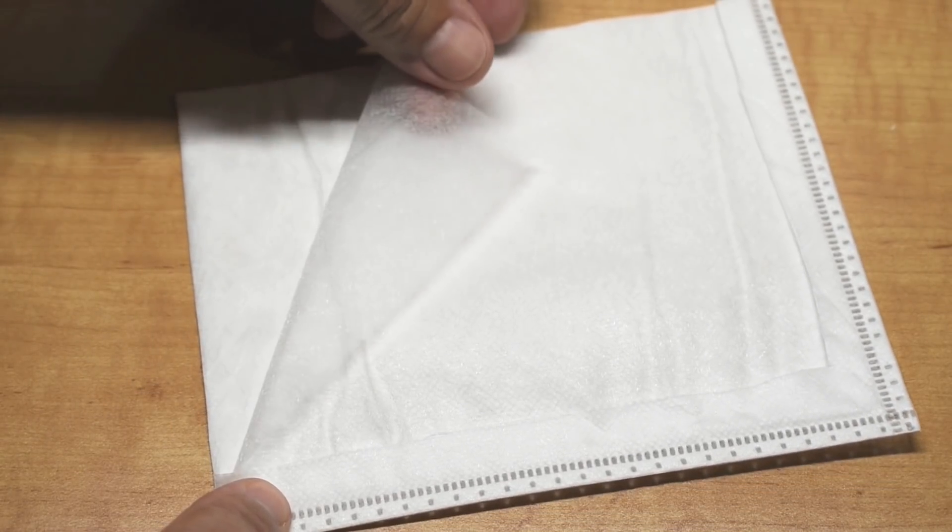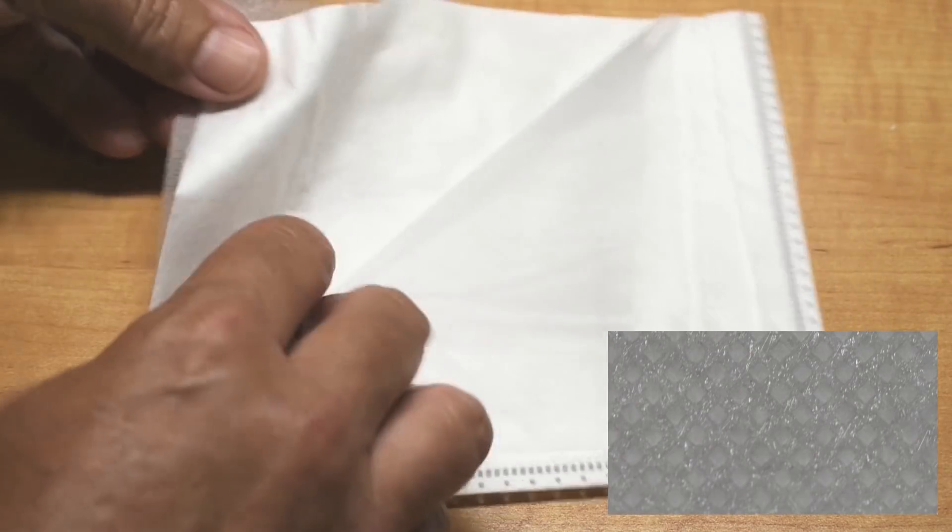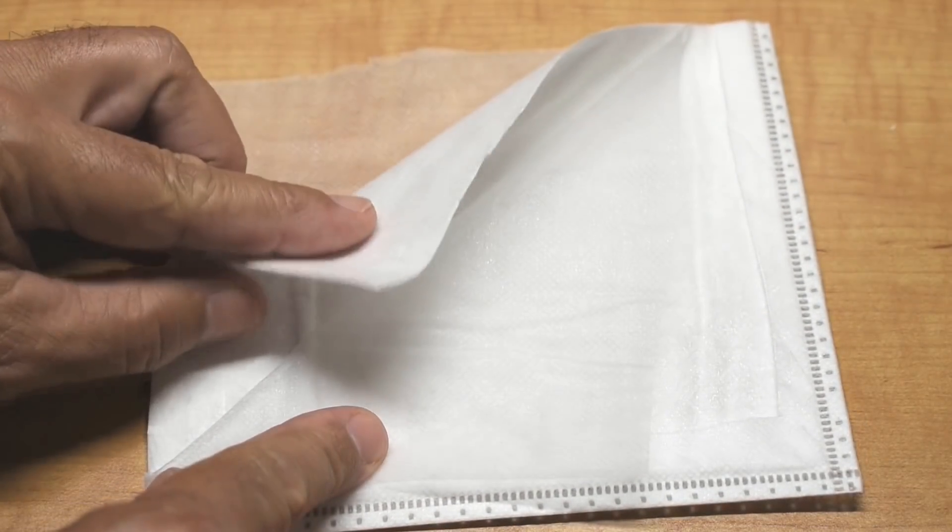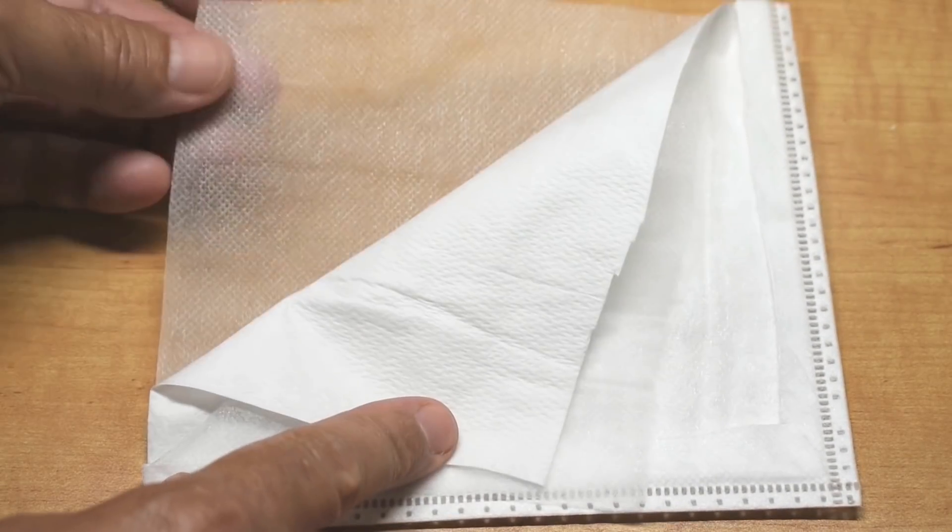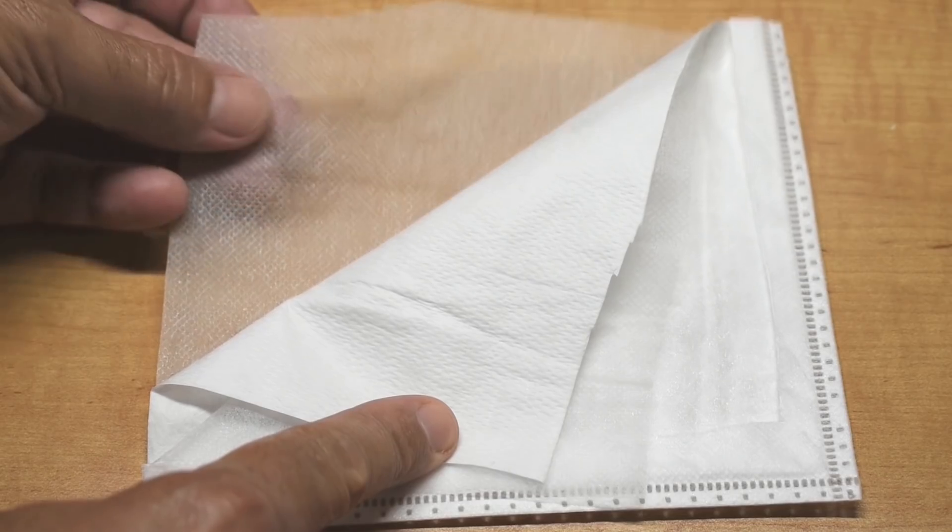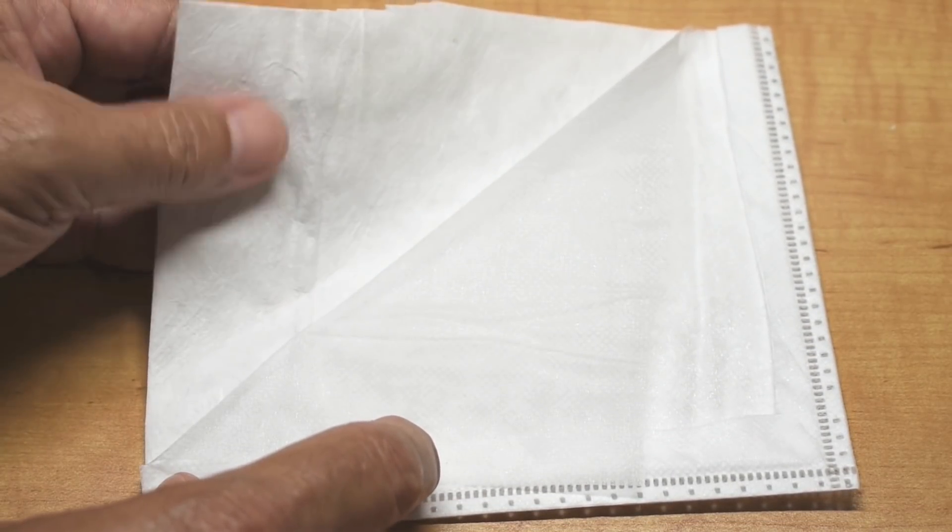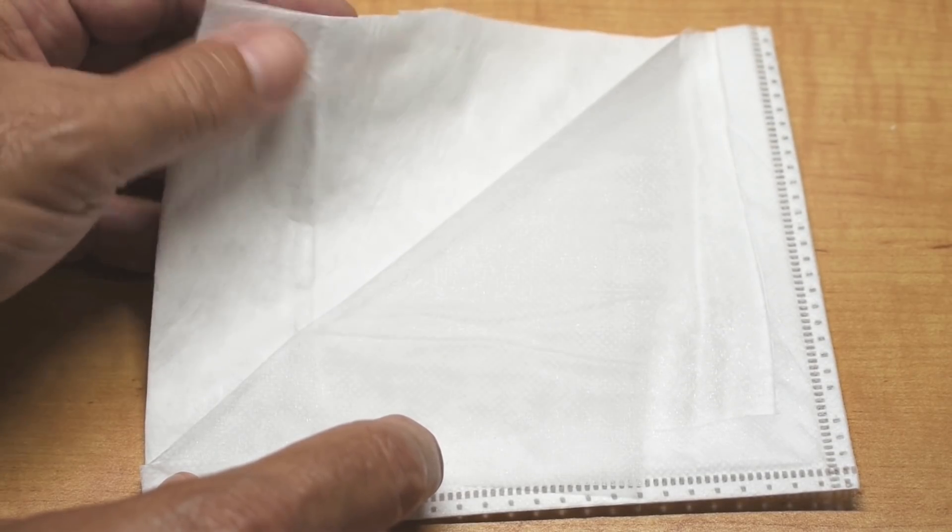You have that thin layer like the N95. And then in the middle you have that thicker layer, just like the N95 mask. And over here, just like the N95, you have that other layer. So this one has a little bit less in the center compared to the N95, but it is a thick layer.